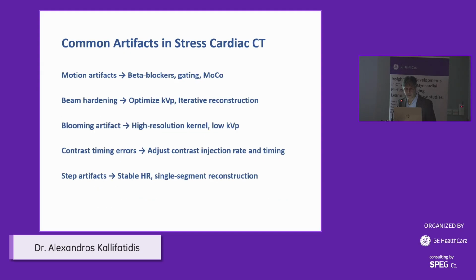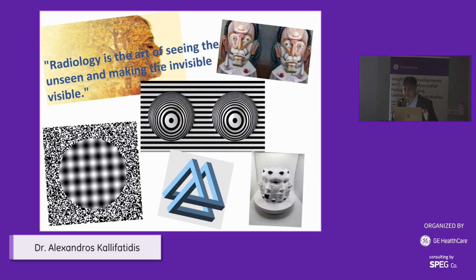And don't forget that artifacts are quite common in our daily clinical practice. We are learning to face them. We are learning to live with them. We have to know them in order to avoid misinterpretation. And finally, after all, radiology is the art of seeing the unseen and making the invisible visible.